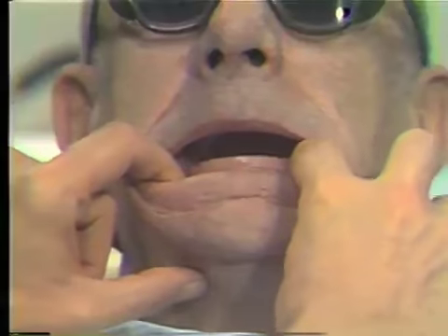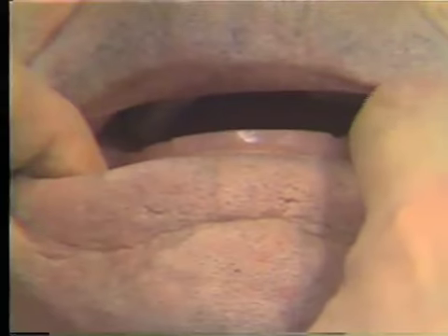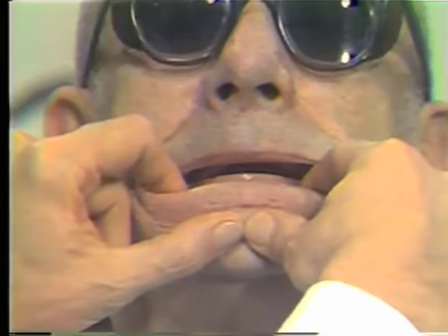For this purpose, our patient is well trained in closing in centric relation, but it is important that we hold this lower rim firmly in position, one finger on either side on the first molar region of that acrylic tray, and our thumb under the mandible, not out in front and pushing back, but under the mandible.